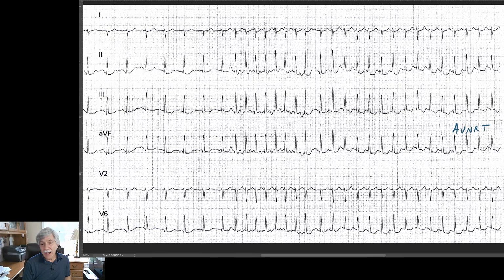And the reason I say that is when you don't see visible P waves, it's possible that the P wave is buried in the QRS complex. And I have a whole section in my advanced course on ecgacademy.com on how to recognize where the P waves are. But anyway, in AV nodal reentry tachycardia, you generally don't see any P waves.